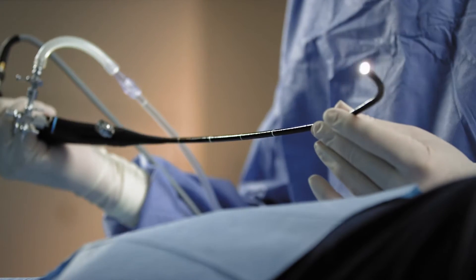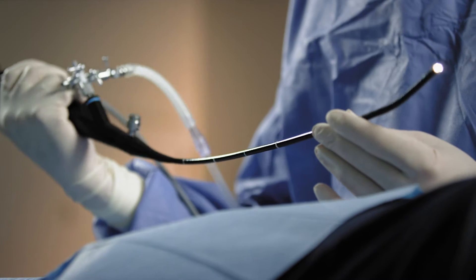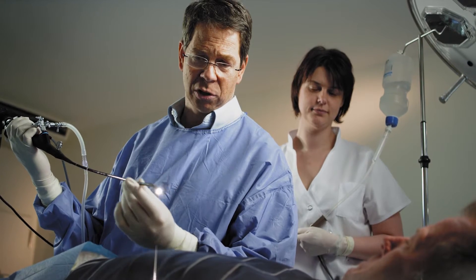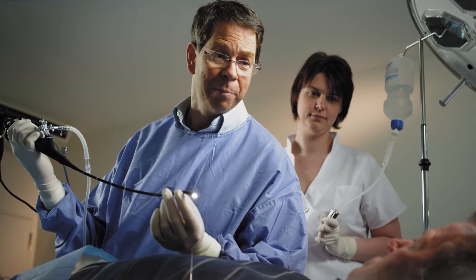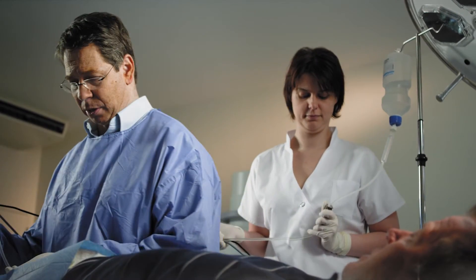During the cystoscopy, a small optic is inserted into the bladder to carefully examine the body for diseased tissue. The purpose is to find the source of the bleeding and make sure there is no malignant tumor present in the bladder.